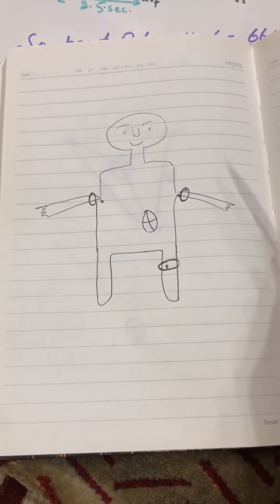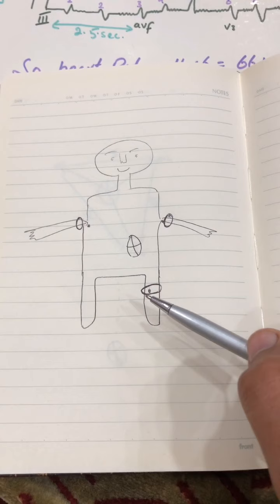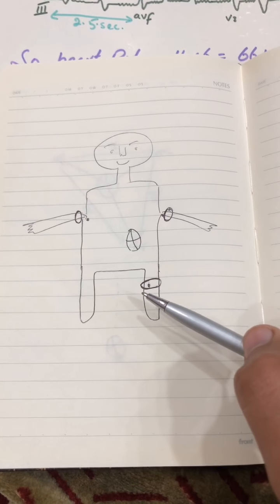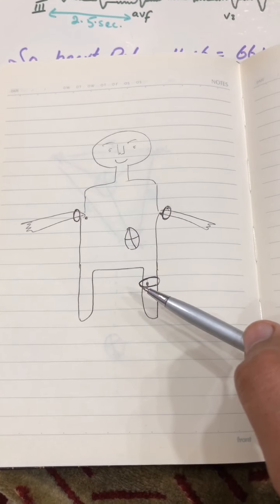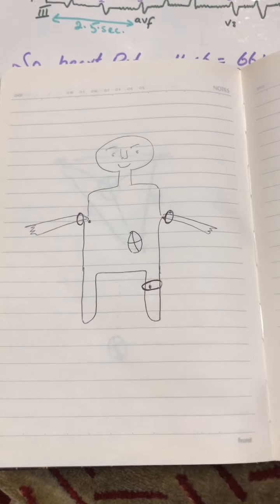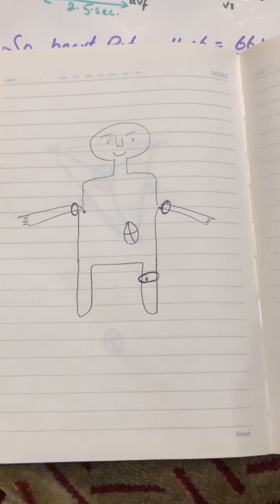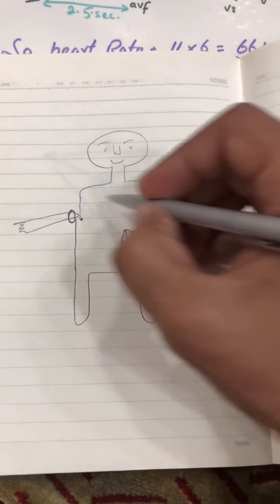Okay, so if I'm talking about the left foot, or just foot lead, or lower limb lead, it means that I'm talking about only the left foot. Okay, so let's see what kind of leads are over here.